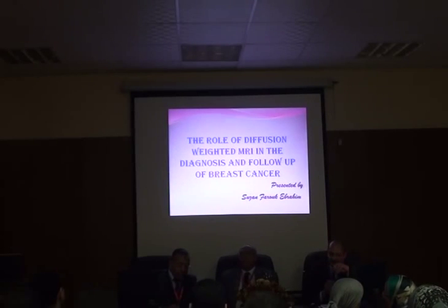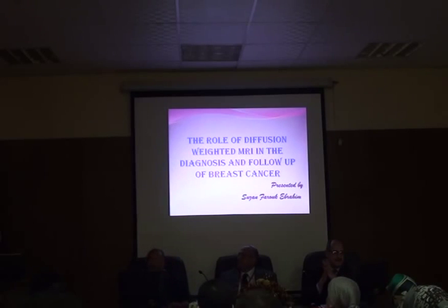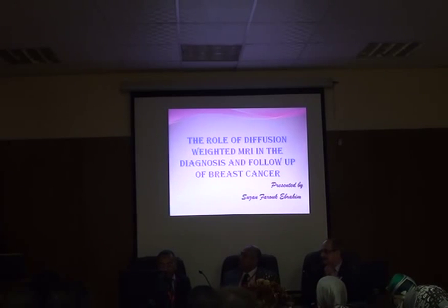Diffusion weighted imaging diagnosis of malignant breast lesions and post-operative follow-up by Dr. Suzanne. Today we're going to talk about maybe the main topic of the lecture, the role of diffusion MRI, diffusion weighted image in the diagnosis and follow-up of breast cancer.